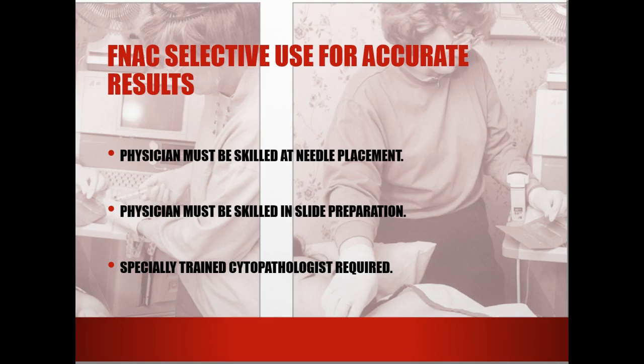So there's a new product that quite a few vendors have out there right now, and it's an RF, radio frequency, type of technology. The radiologist can put the needle in, and the needle deploys a small transmitter, the size of the head of a pin, that gives off a radio frequency or a magnetic type of signal.